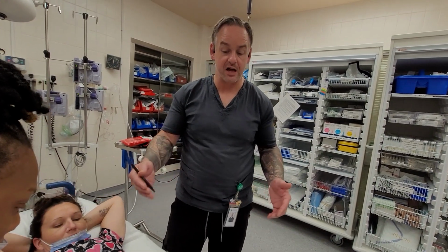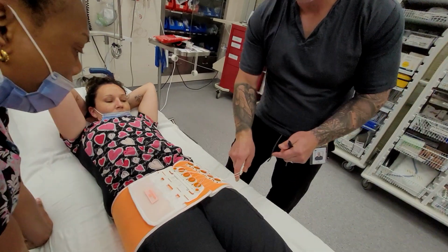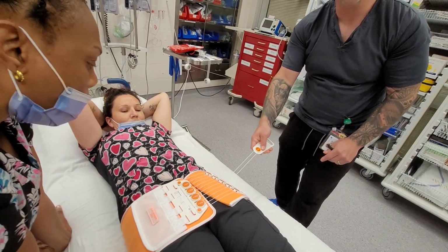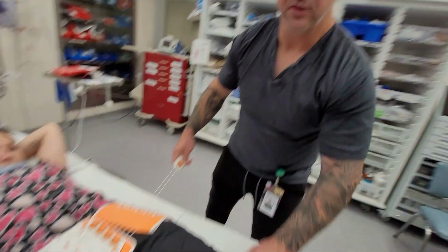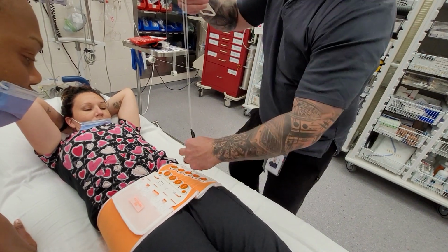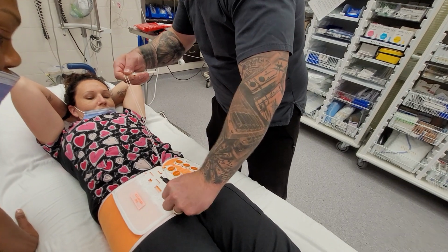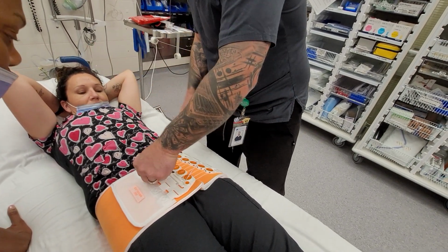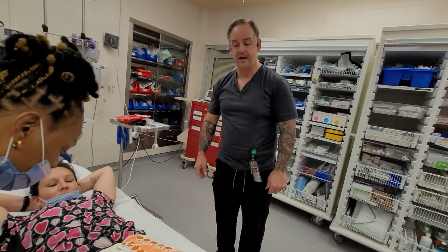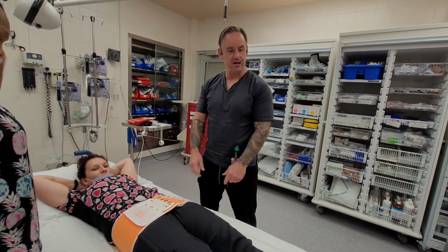So your physician can actually instruct you in that aspect, and then you can come along and you can just relieve the tension for a few minutes. Make sure you've got good circulation, do your assessment, and then pull it again nice and tight. Again, with an awake patient, that may not be a very fun thing for them, so it will be very patient specific and physician specific, but that is something that you must keep in mind. And that's the application of a pelvic binder.